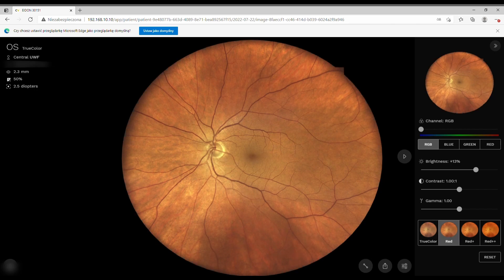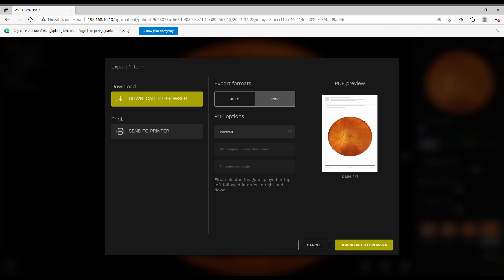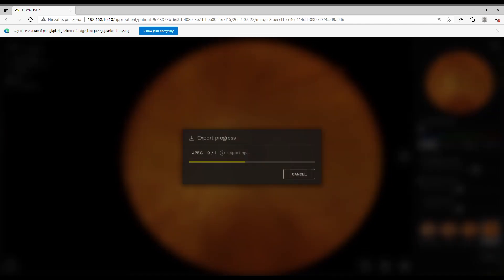Because this is an SLO, the colors are unnatural. But if you use Red Plus Plus, it looks like old Topcon devices. You can download everything as JPEGs or PDFs. If you use PDFs, you can choose portrait or landscape orientation.